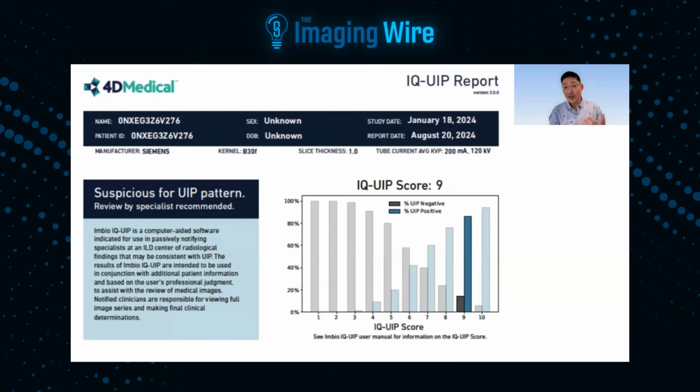And so you could take that data and digest it, and then make your own conclusion based on your opinion as well, right? I think it's important because there's certainly going to be a difference between a QUIP score of 9 and 10, which is a high confidence score, or something like a 7 and 8, right?